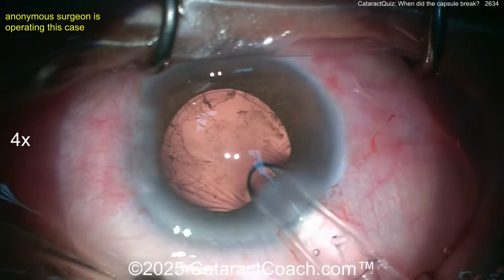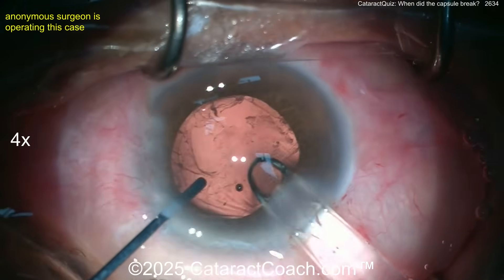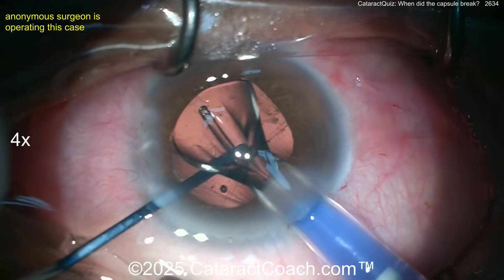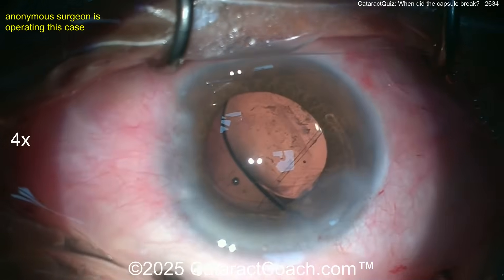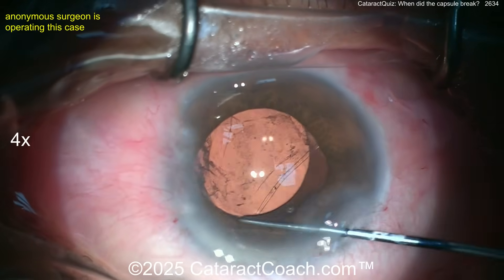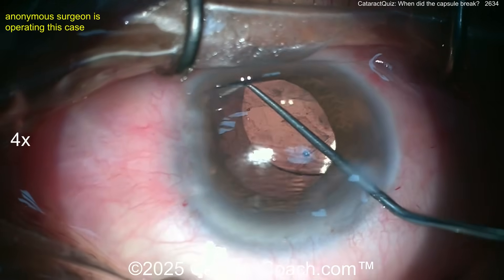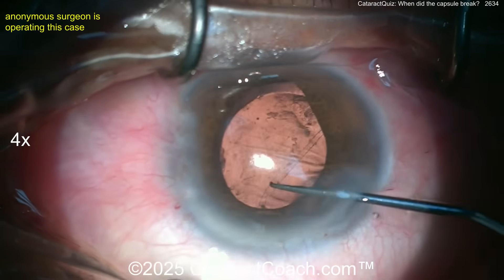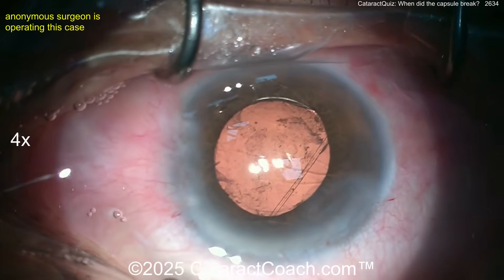Here comes a lens. Let's see what kind — deliver, deliver, deliver. Oh, it's a single piece! Whoa — putting a single-piece lens in the bag. You can do that, but be very careful because one part of the bag is wide open. Unfortunately the lens already opened up. Avoid too much manipulation; this has to go in the bag. Do not put a single-piece acrylic lens in the sulcus.